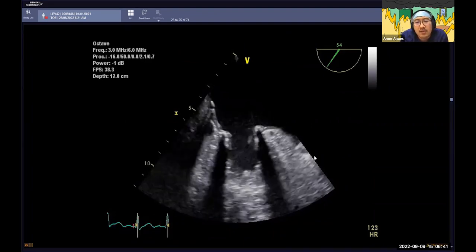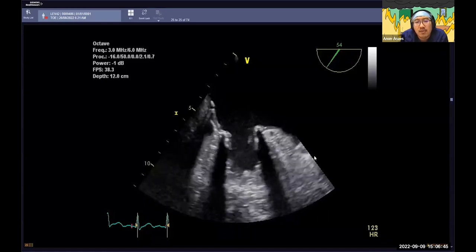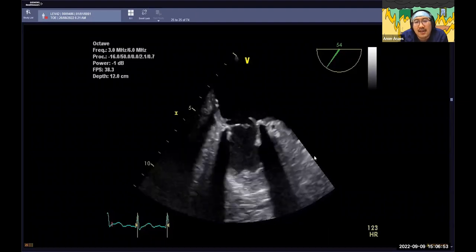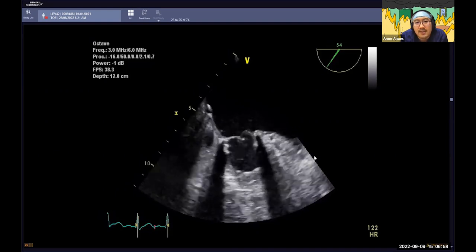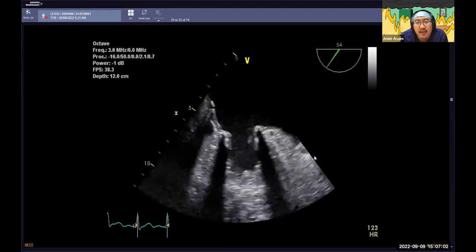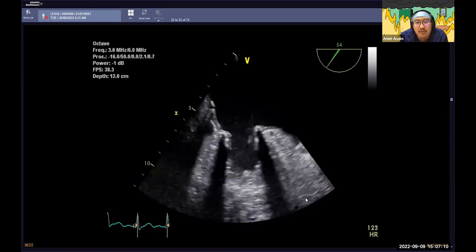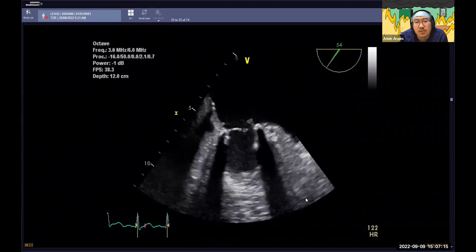But especially for the surgeons, who are going to view this later, if you capture a good 3D render with the LVOT at 12 o'clock and the mitral valve underneath it, that's a view that the surgeons understand. You can walk around this at 0, 50, put color, 90, 120, et cetera, get 12 images. But a good 3D will explain everything that is happening to this valve in one loop. The patient doesn't need to be holding their breath. Patient doesn't need to be in sinus rhythm. A single image will show you what 40 other 2Ds will try and tell.